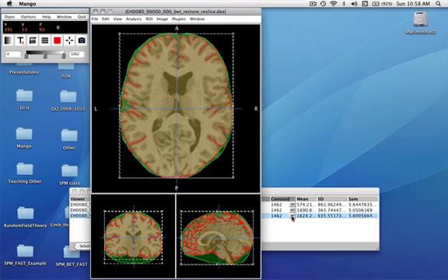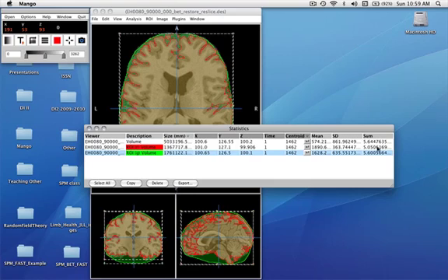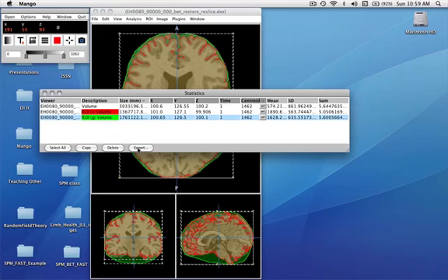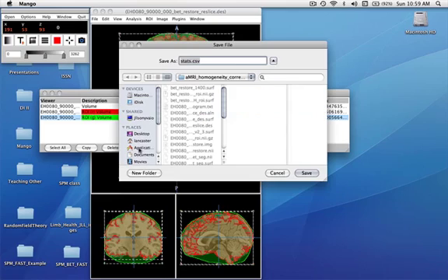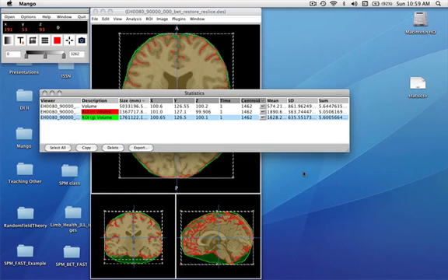It basically goes to the same location in all three cases. We also provide a means for giving you the mean value, standard deviation, and sum. All of this information, though nice here, you generally want to have it in a spreadsheet. We've created a way to export this to a spreadsheet. Here we'll do it to the desktop.